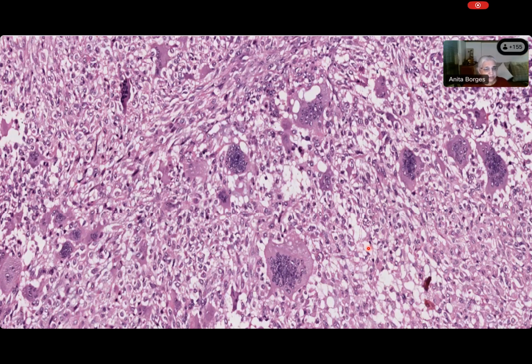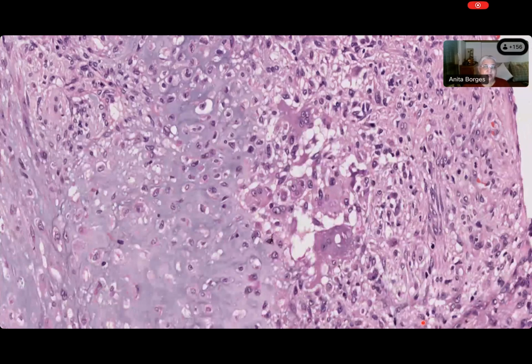That means for every section of the stromal cells, you will have 1, 2, 3, whatever giant cells, and that pattern is repeated everywhere. Is that pattern repeated everywhere? No. You have areas like the top left-hand corner, the bottom right-hand corner, which are devoid, no? Irregular. So then it is irregularly distributed osteoclast-like giant cells. Very good. Now what do we see over here?